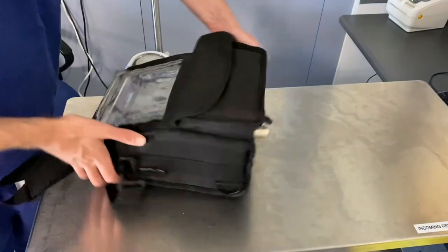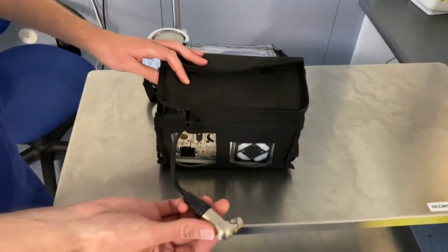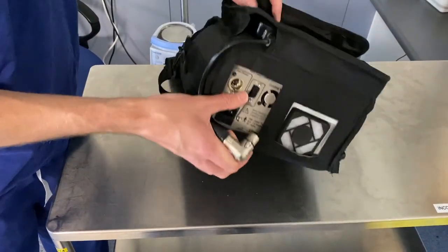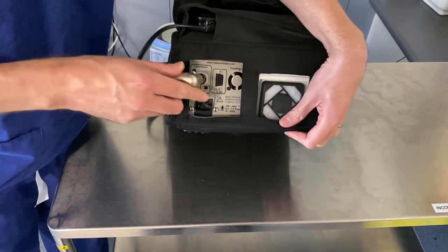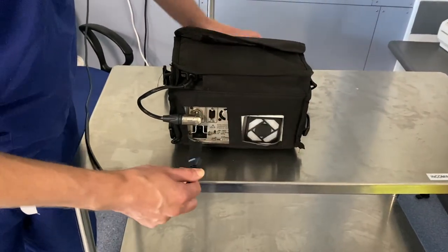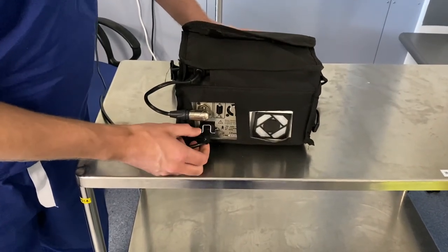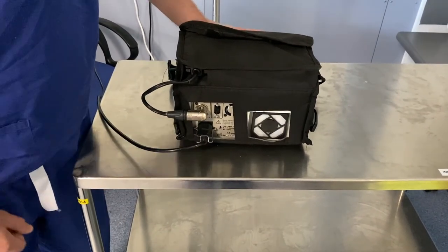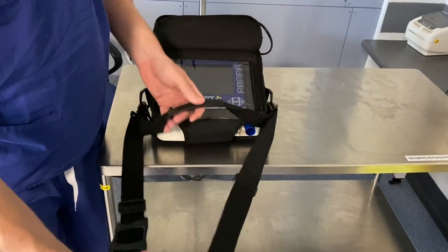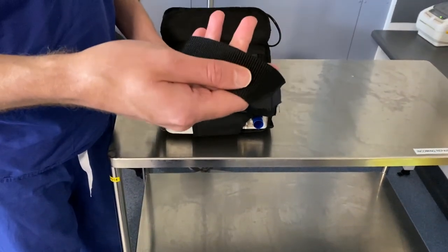Turning around now to the back of the machine, pull the external battery connector out and connect it in place. Finally, connect the power cable into the back of the device and pull the silver guard over the top. There's a strap and a carry handle which can be used for mounting the device onto your wheelchair, or you can use the strap to carry it over your shoulder.